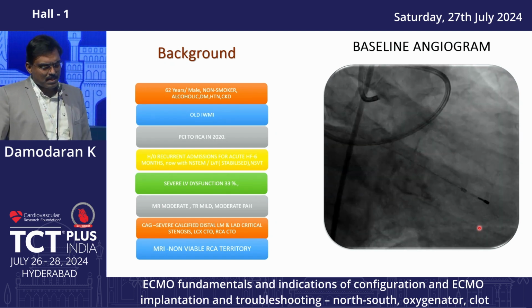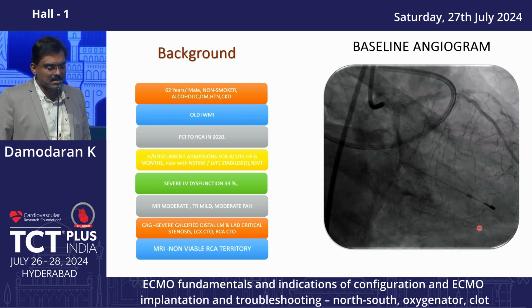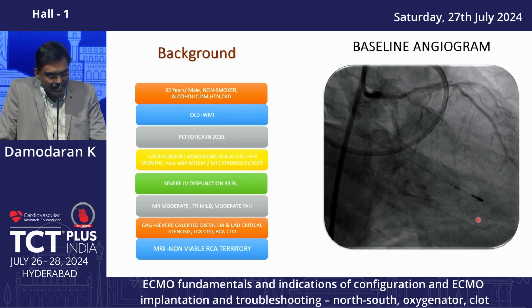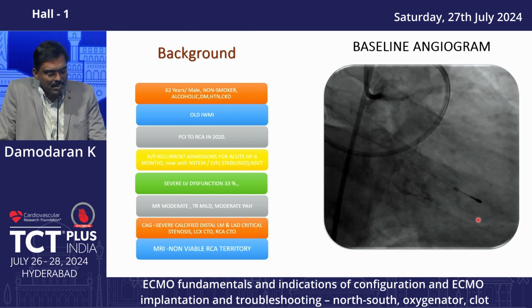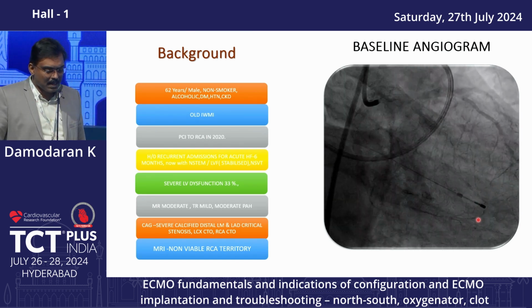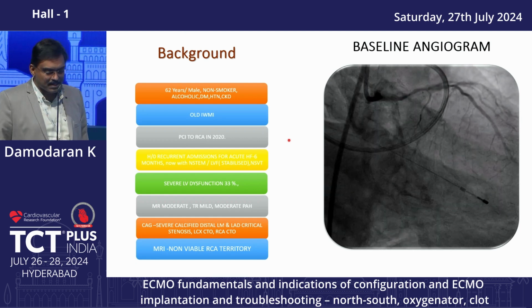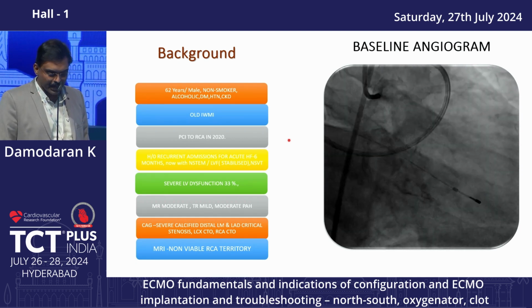If you look at this patient, obviously one can say we can go for a PVAD, but the issue is twofold. One is a clinical challenge, the other is an economical challenge. The clinical challenge is that this patient has been having some hypoxemia, requiring some oxygen, and had a VT. I thought we need to have full support when the patient crashes on the table. The second is that ECMO in our center at least is one-sixth the price of PVAD in this country. This patient was a surgical turn down, turned down by a surgeon, so we need to offer them some form of therapy.